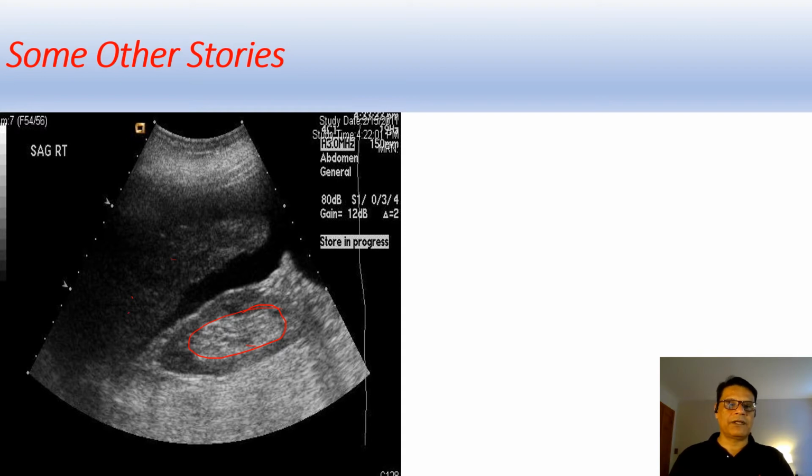And if you see this area, it has no echo. Actually, this is the presence of fluid. No echo is returning from this area. It means the pulses are passing through this area and they are not producing any echo. So this area is devoid of any echo. Here are echoes, here are echoes, all over there are echoes, but there is no echo over here.